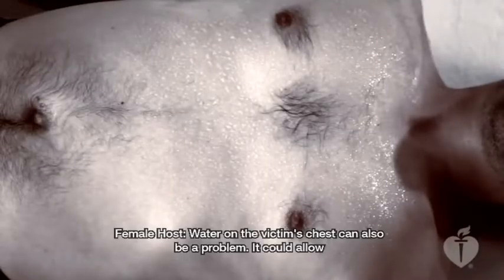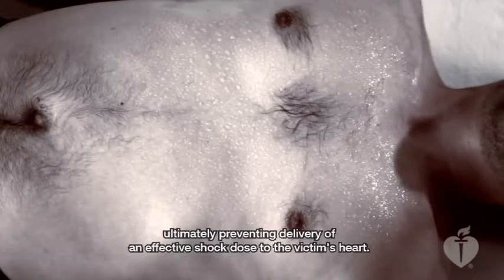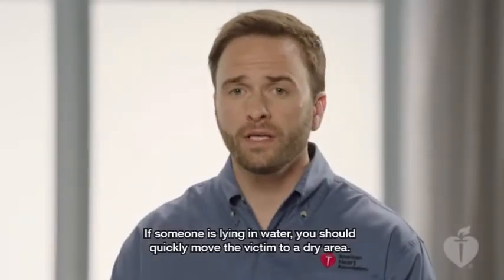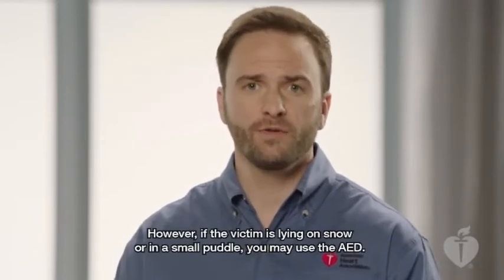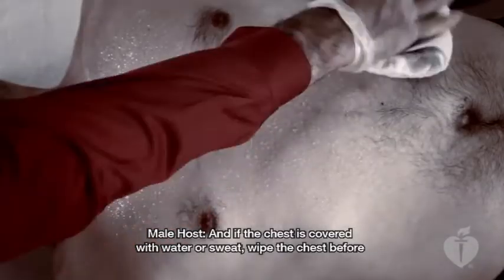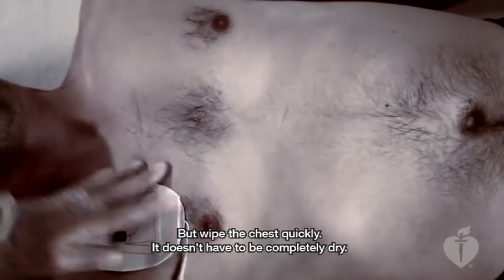Water on the victim's chest can also be a problem. It could allow the shock to travel through the water between the pads, ultimately preventing delivery of an effective shock dose to the victim's heart. If someone is lying in water, you should quickly move the victim to a dry area. However, if the victim is lying on snow or in a small puddle, you may use the AED. If the chest is covered with water or sweat, wipe the chest before attaching the AED pads — but wipe quickly; it doesn't have to be completely dry.